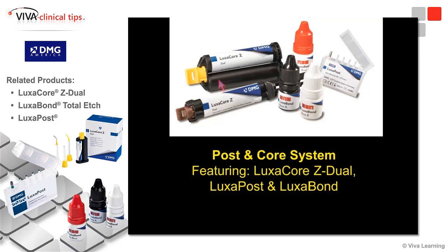The reason we're going to use LuxCore Z is because the film thickness, addressed earlier at 20 microns, basically classifies LuxCore Z as a cement — it's thin enough to be considered a cement. We're going to use LuxCore Z as a cement for the posts, and because it's dual cured and the bonding agent has dual cure abilities, we can use it in a dark space without worrying about getting a curing light all the way down to the bottom of a canal.